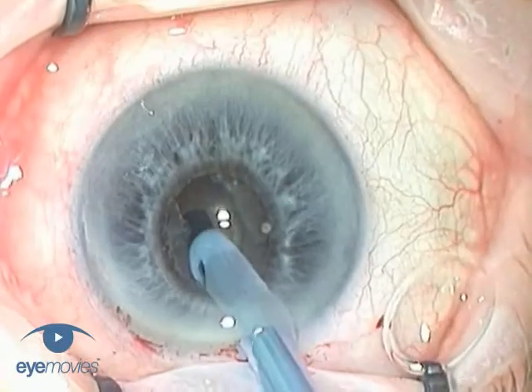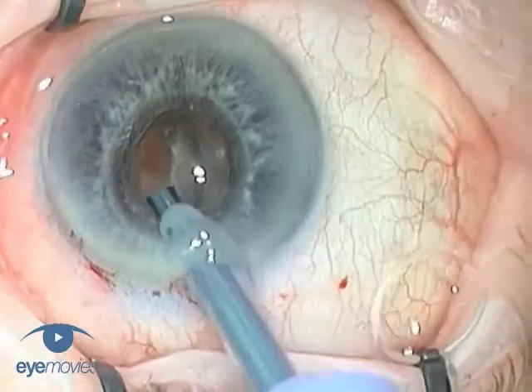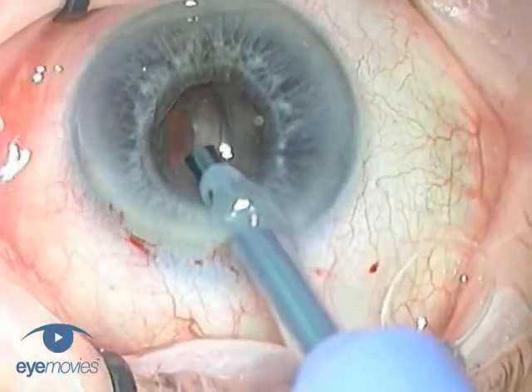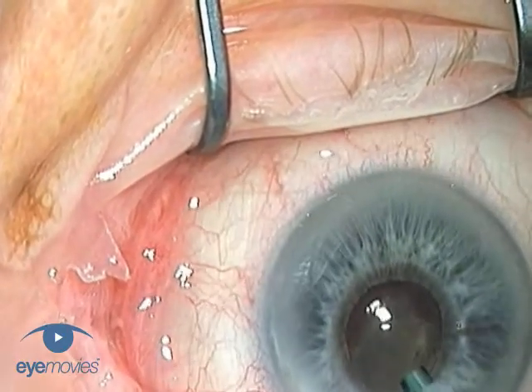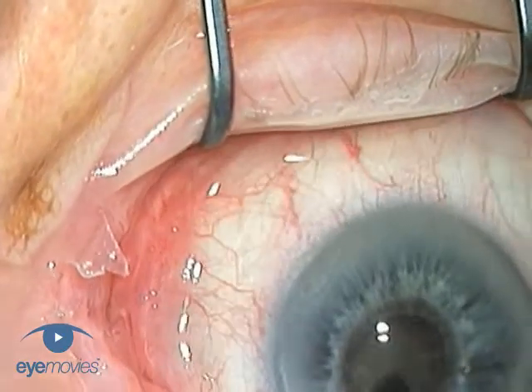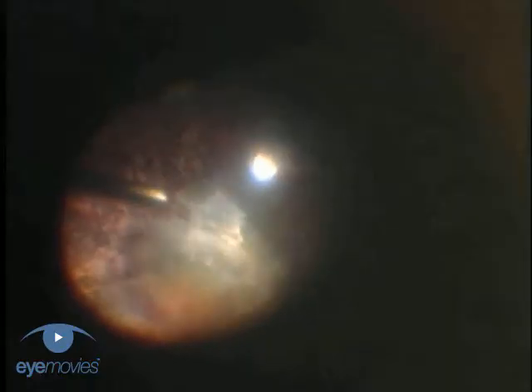Posterior capsular tears occurring early on during phaco are relatively rare, but they're always difficult to deal with and to get a good result. The two major challenges you face are firstly to successfully remove the remaining nucleus without dropping any of it into the vitreous, and secondly to avoid tearing the retina through vitreoretinal traction.